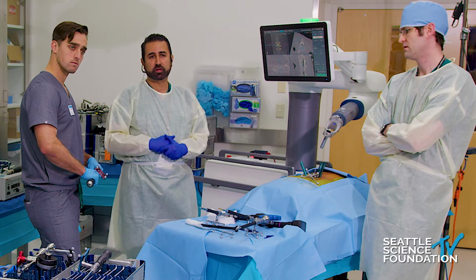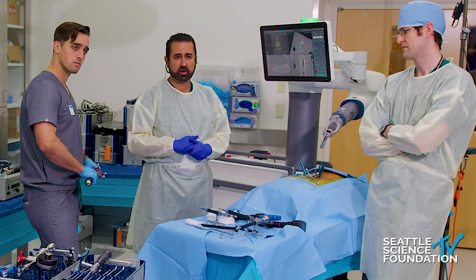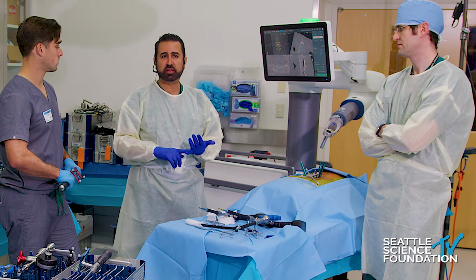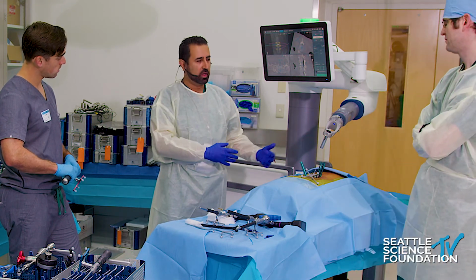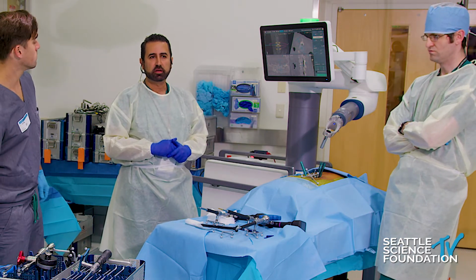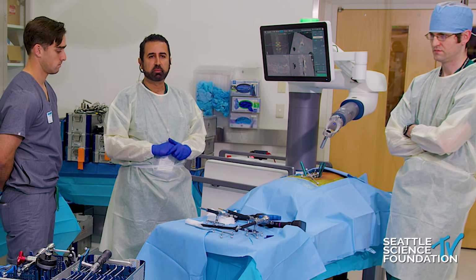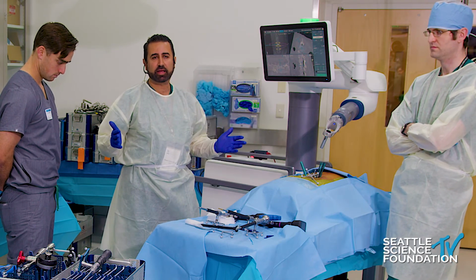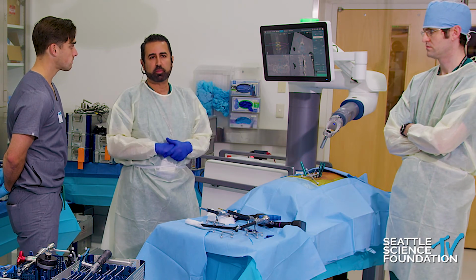Yeah, it's such a good point. Naturally, like you said, they're fine cuts, 1 millimeter preferred or less. So it's more than your standard radiation. But compared to before, where I would get a preoperative CT to look at the bony anatomy, and then I would maybe get an O-arm spin in the OR, and I'd bring C-arm in and take a bunch of fluoro shots, let's say percutaneous, using K-wire and Jamshidi needle, now I just get the one preoperative CT. I don't have the data for you, Jens, but I believe it's out there. But in my anecdotal practice, that is less radiation, I believe. Yes, it's more because of the initial outlay of the fine-cut CT scan, but I'm avoiding an additional CT scan, whether it be intraop or as part of preoperative planning before the surgery.